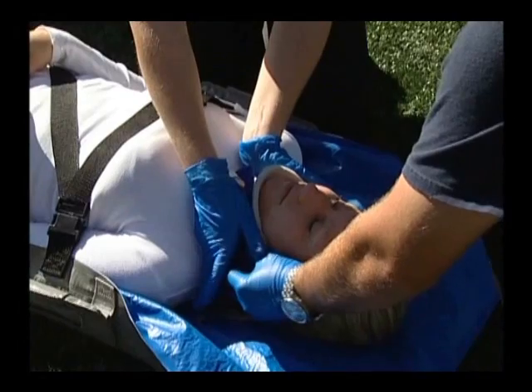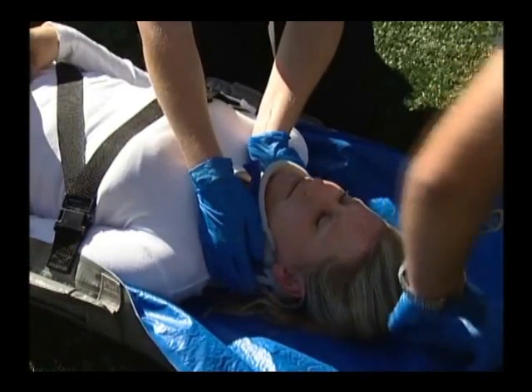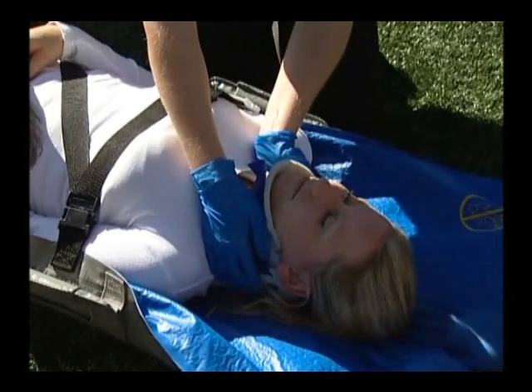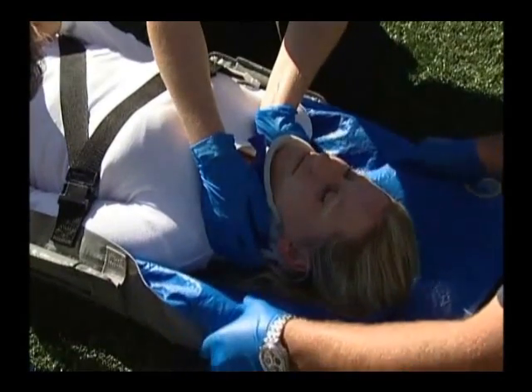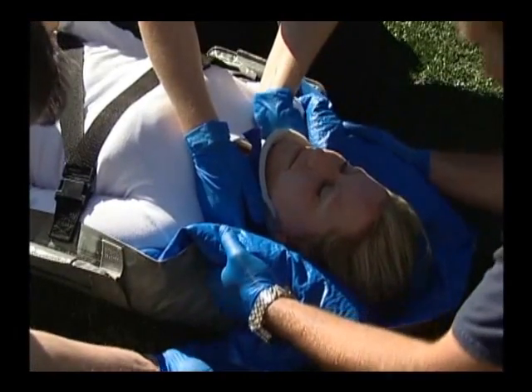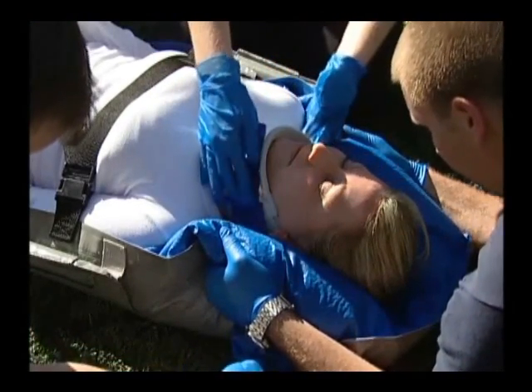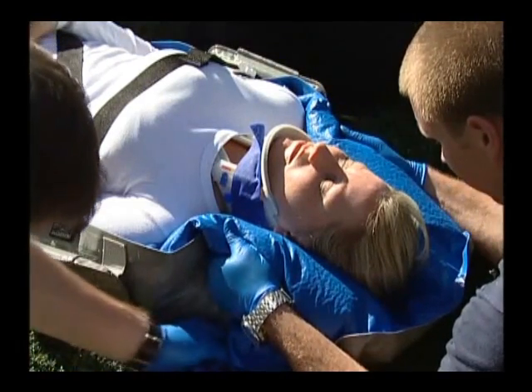Push any beads away from the area above the patient's head, but do not alter the support under the patient's head, which is maintaining neutral alignment. Shape the mattress around the head, making sure to fill the voids by the shoulders and the base of the neck of the patient. Transfer stabilization to the outside of the mattress and continue to hold these head blocks that you have formed until the mattress is evacuated.